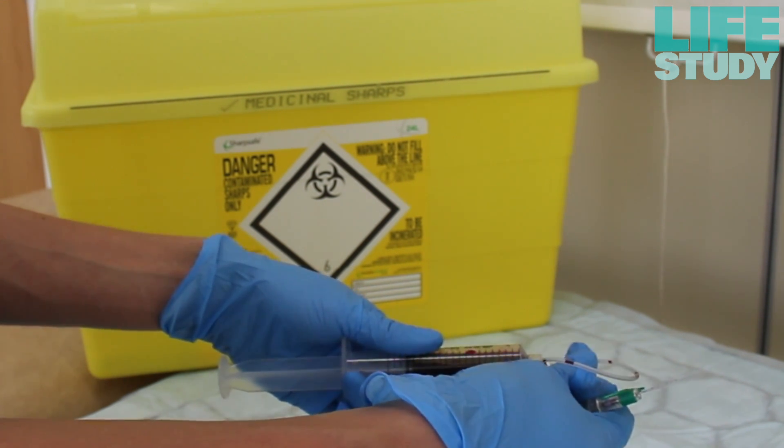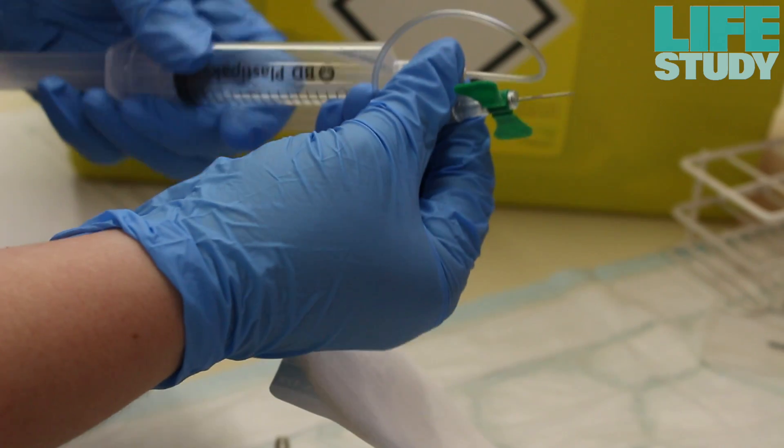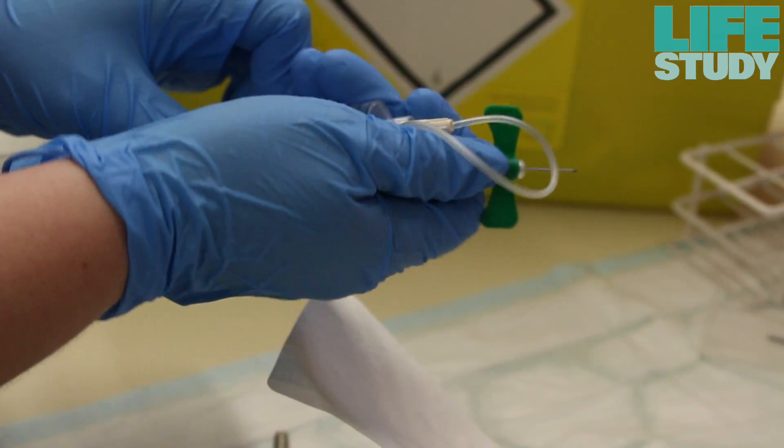Remove the syringe from the butterfly tubing. Discard the butterfly needle safely into a sharps container. Attach a clean butterfly onto the syringe containing the cord blood.